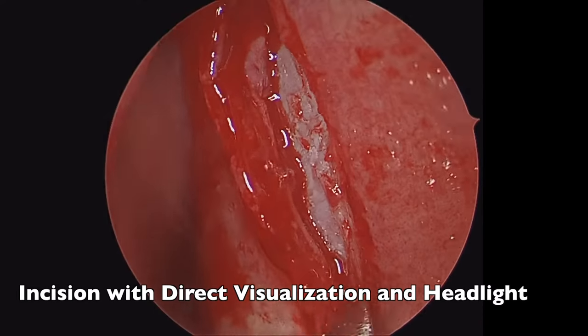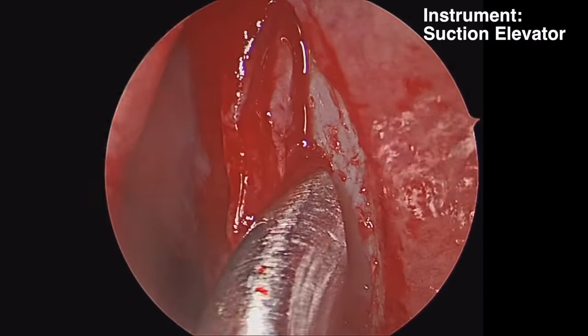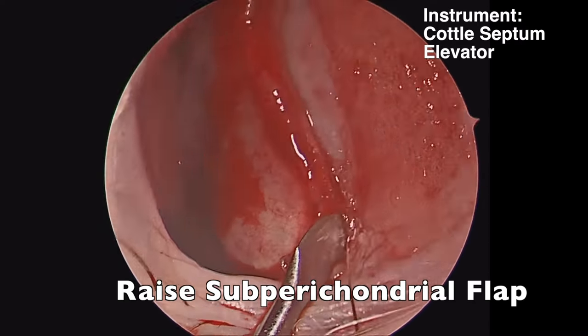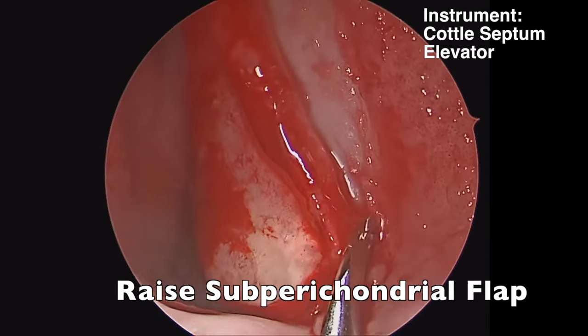We made an incision using a headlight on the anterior septum. This is a Killian-type incision behind the caudal edge of the nasal septal cartilage. Once we've made our incision, we can use the endoscope to improve visualization.